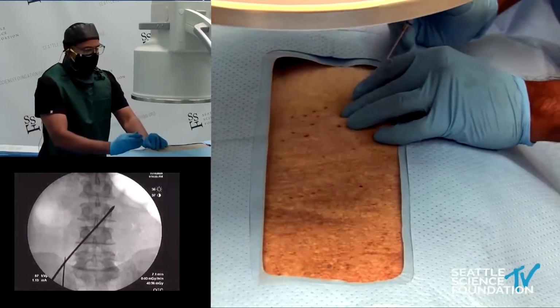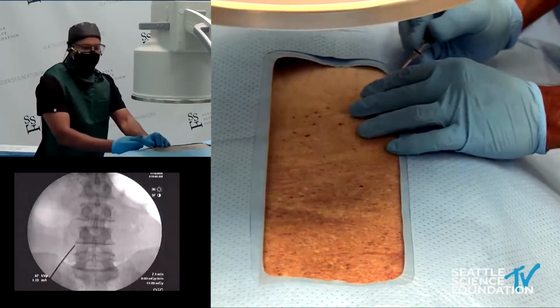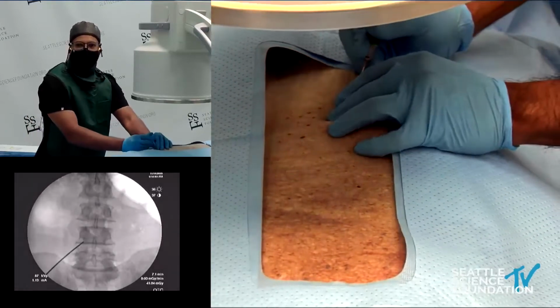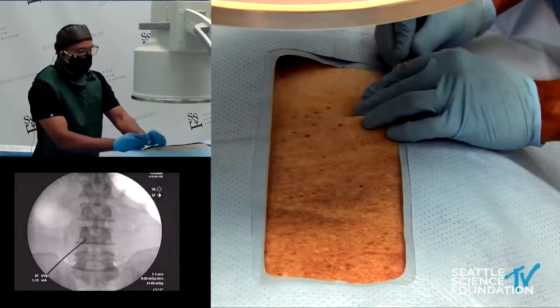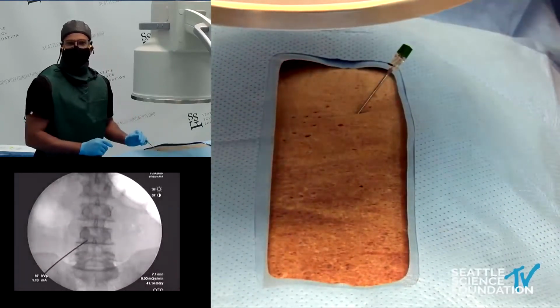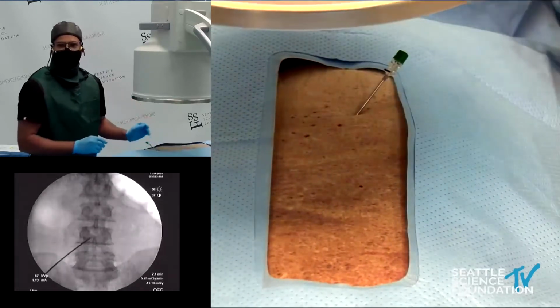So basically, I'm going to follow that angle to that interlaminar window. And we're going to touch down on the lamina. So I encourage you to feel the bone here. I'm going to angle my way in towards the spinous process. And Justin, if we could collimate, since I like to reduce my radiation exposure.